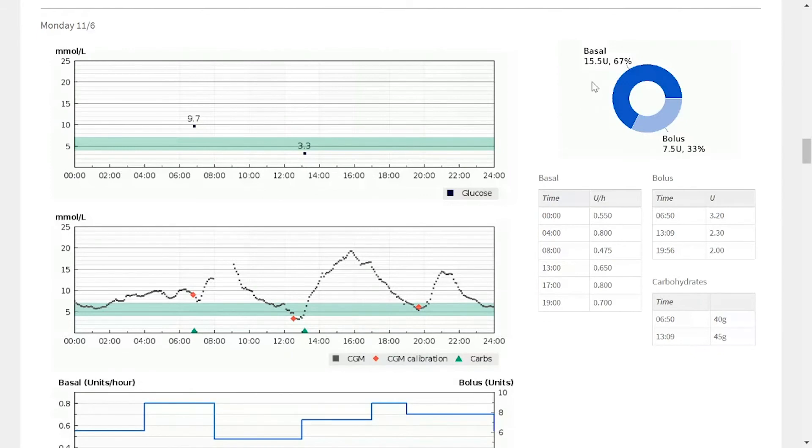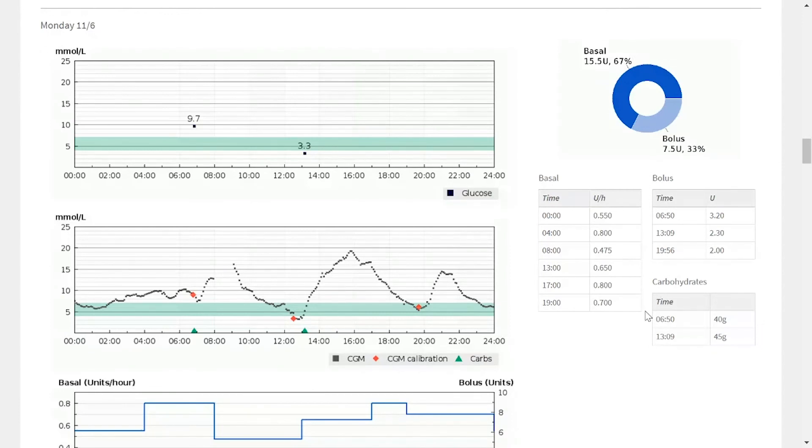On the right-hand side, you'll also see a donut graph showing the percentage of basal to bolus and any specific time changes in the basal profile, as well as the exact bolus amounts and times.